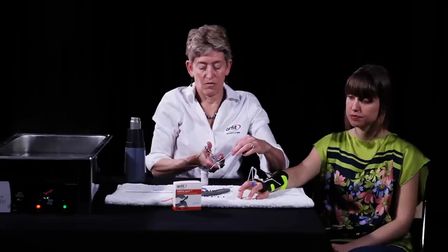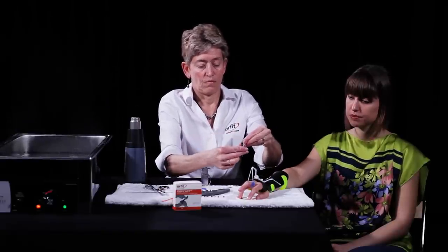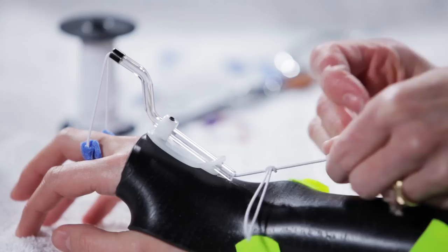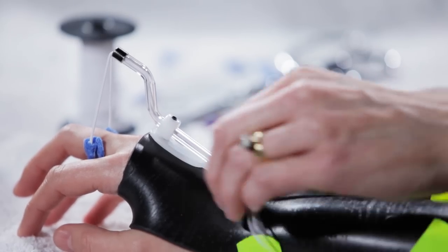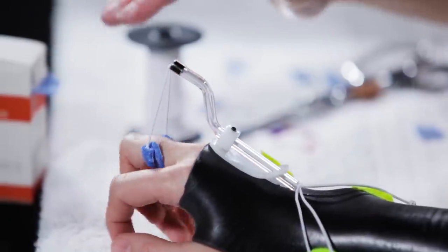Cut another short piece of elastic thread and fold it in half. Form a slip knot over the elastic threads. This creates the tension necessary to support the finger in extension. The patient is allowed to flex the finger and the orthosis assists in dynamic finger extension.